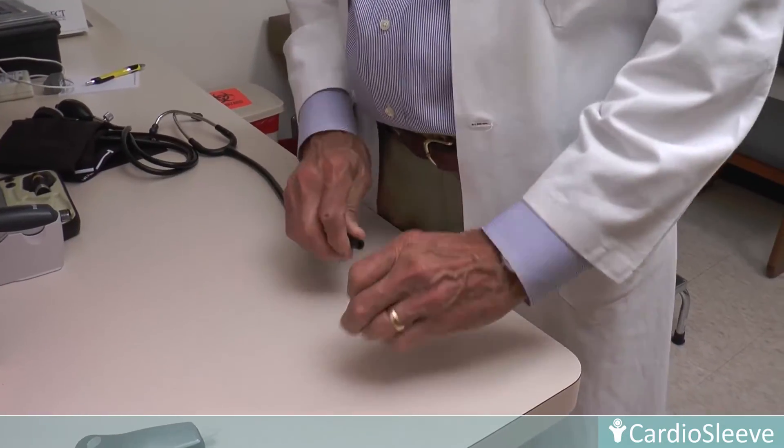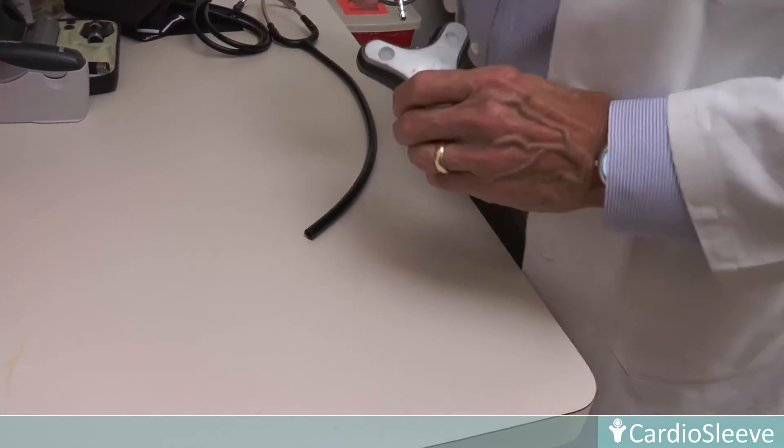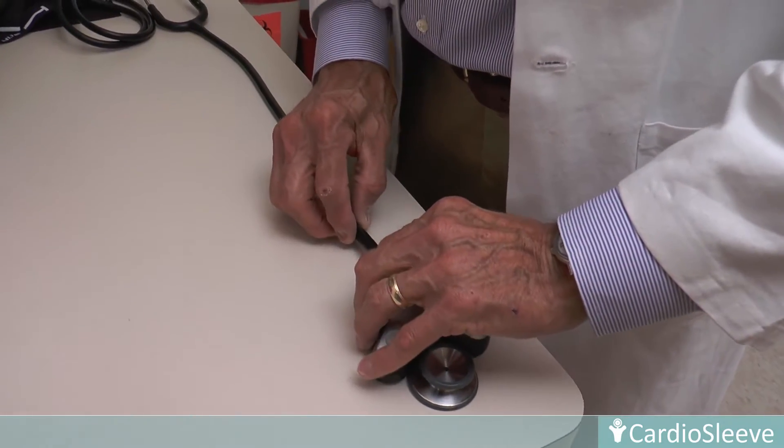CardioSleeve's intuitive design enables its attachment to any standard stethoscope. The chest piece is detached from the tubing and the CardioSleeve is then easily inserted between the chest piece and the tubing.